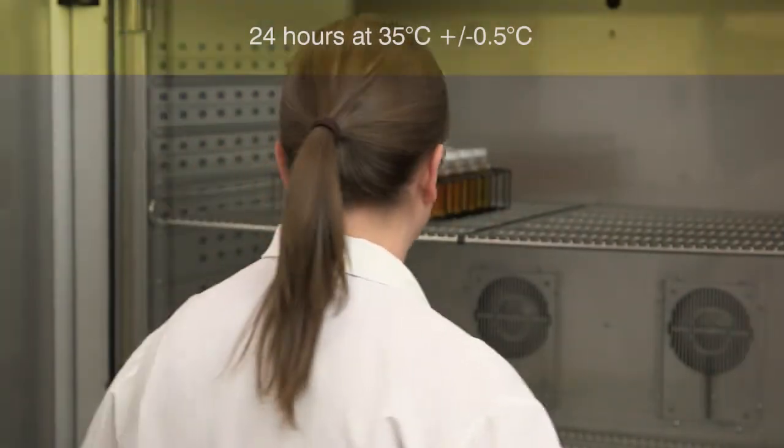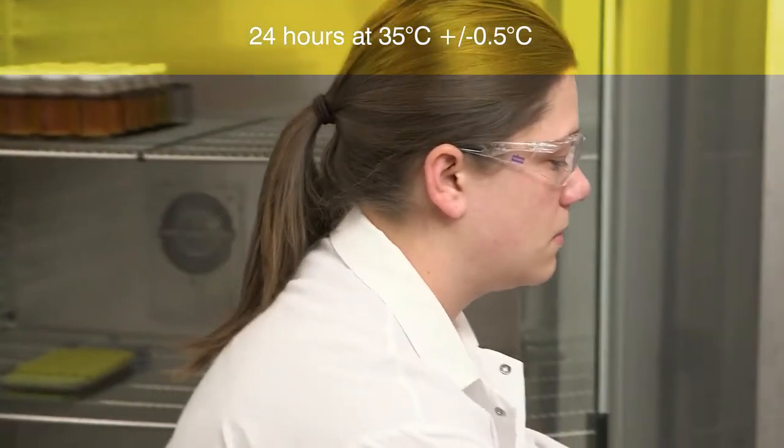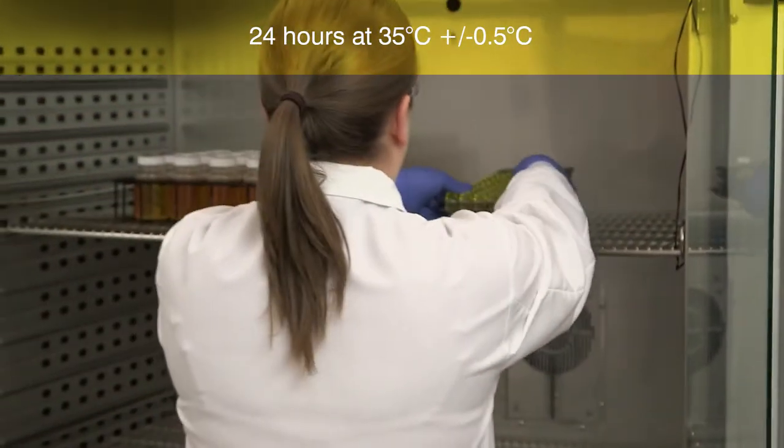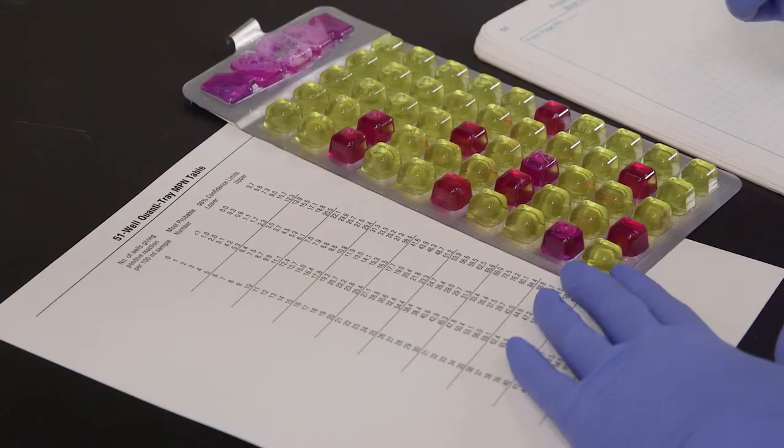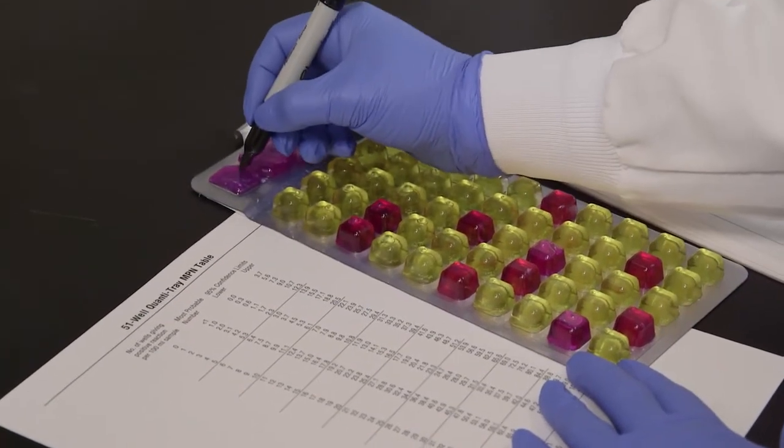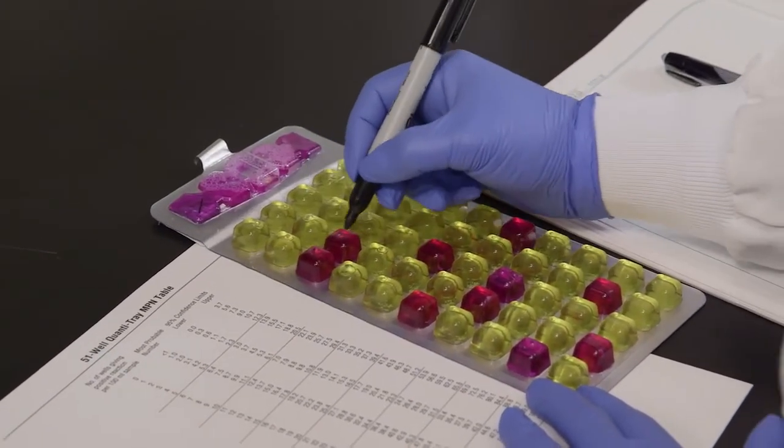Incubate the sealed tray for 24 hours at 35 degrees centigrade, plus or minus 0.5 degrees centigrade, or according to your local regulations. After incubation, mark each red or magenta well with a permanent marker, including the large overflow well.